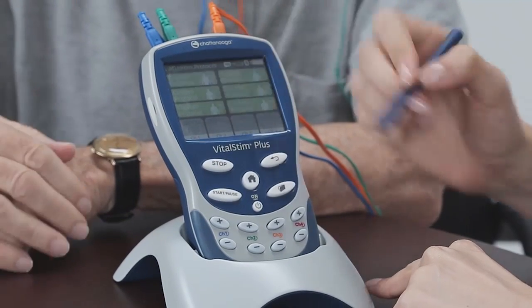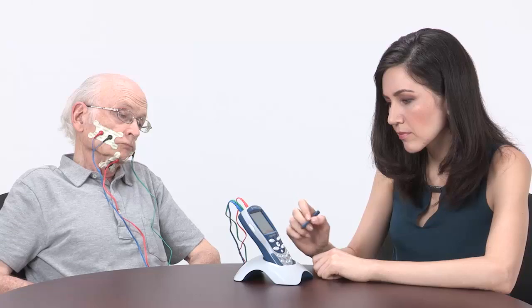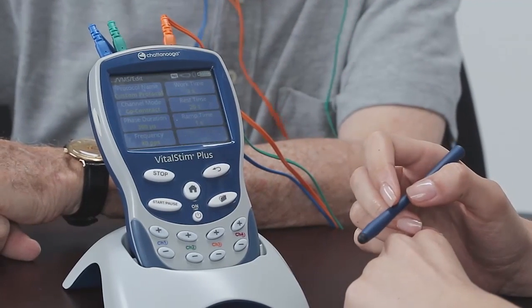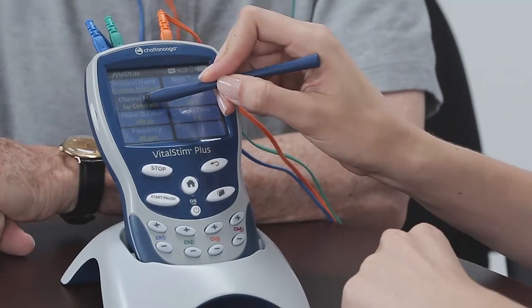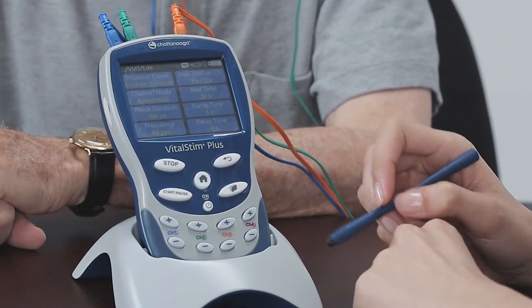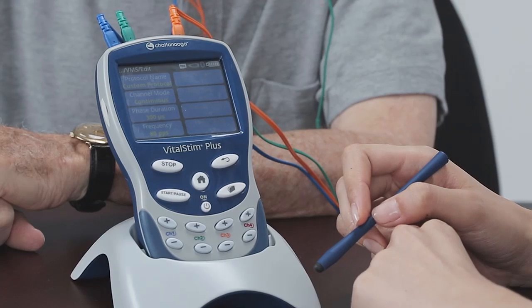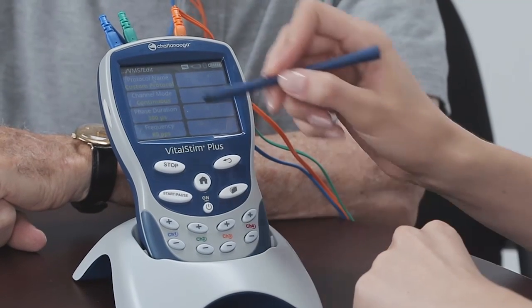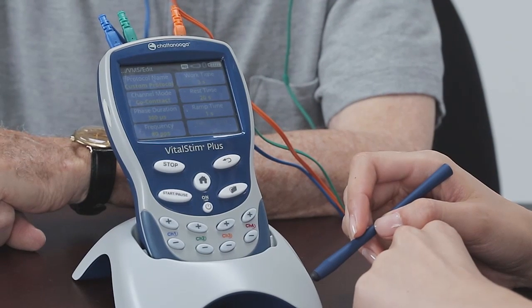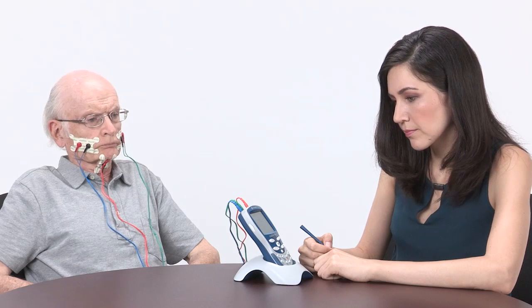The settings that can be edited are first of all the channel mode. 3 different modes can be selected. Co-contract, as it is right now, at which point the current is going to be delivered in both channels at the same time. Reciprocal, at which point the electricity will flow first in 2 channels and then in the next 2. Or continuous. In continuous mode, the unit will just continue continuously in all channels simultaneously. In co-contract mode, the unit will deliver the current, as we said, simultaneously during the work time, and it will then pause during the rest time.